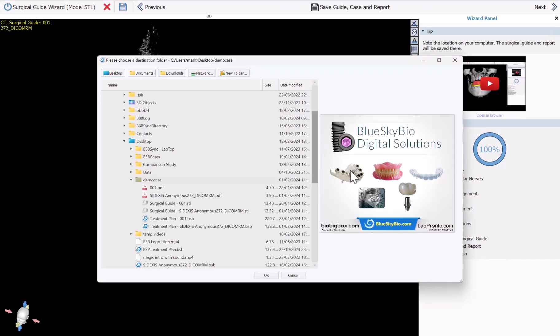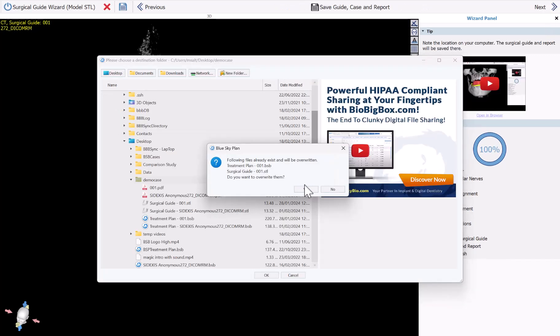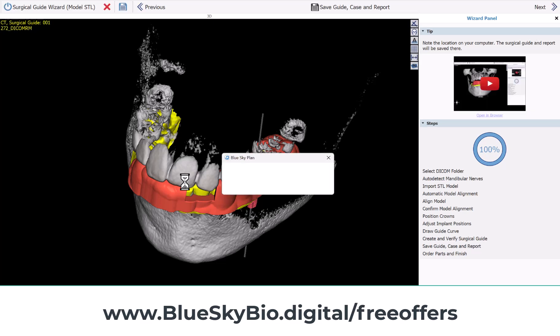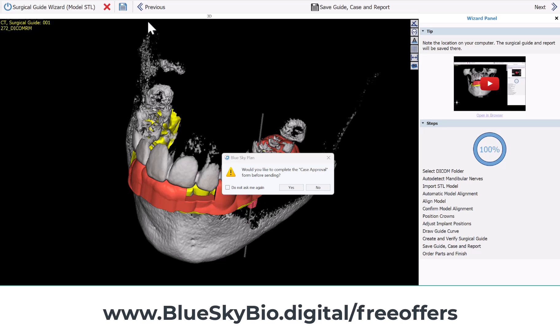We can finish the wizard to save all the data and generate the reports. While that's happening, we actually have a special offer for Blue Sky Bio implant customers — you could get the surgical guide for free including the digital planning and surgical guide fabrication, and you could even get a free crown including the design and manufacturing. You can see information regarding those offers at blueskybio.com/free-offers.